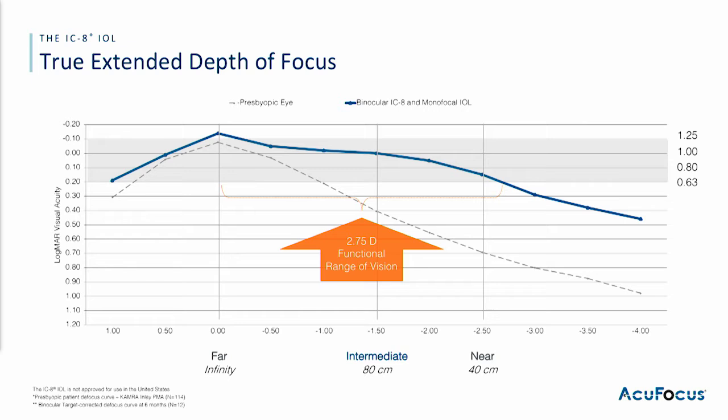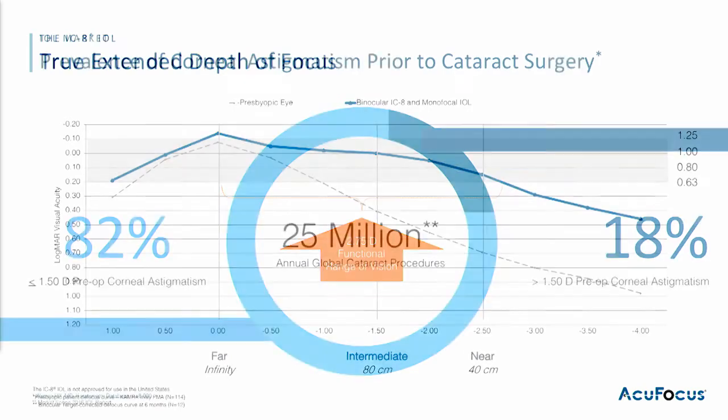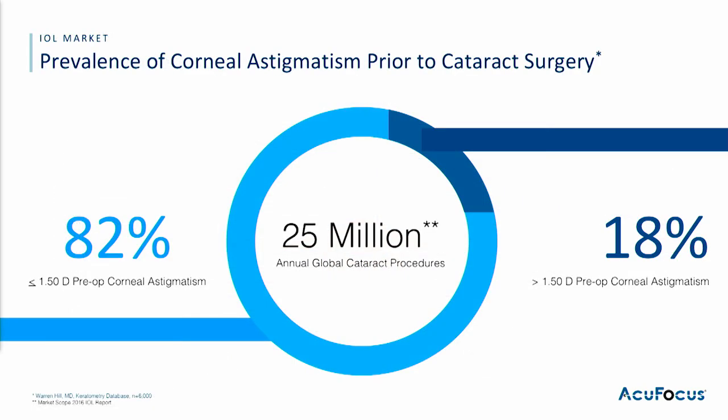Now, through the work that Dr. Warren Hill has shared with us, we know that 82% of patients present for cataract surgery with a diopter and a half of corneal astigmatism or less. We also know that toric IOLs represent a real addition to the surgeon's toolkit, but application can be difficult. There's a lot of opportunity for error, and there's increased expense that can exist for the practice. So for example, toric IOL powers are limited, so that means an exact correction is unlikely, and it's not going to account for surgically induced astigmatism. Ink marking is subjective and skill-based. Digital marking, expensive, but more reliable. And even if you have a perfect procedure and you get perfect alignment, that lens can still rotate after surgery.